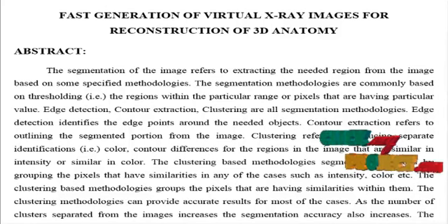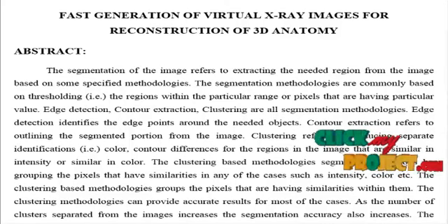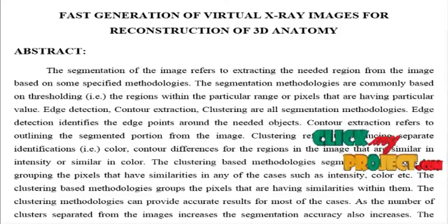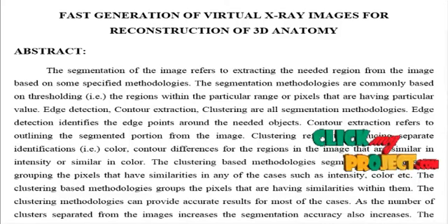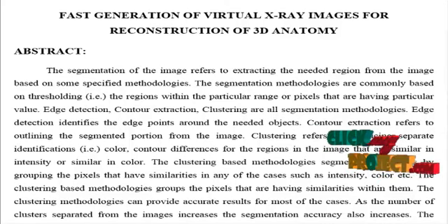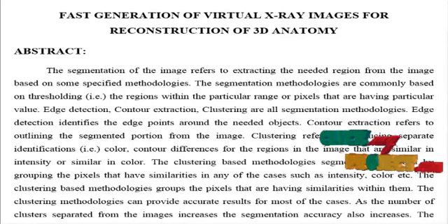The proposed FCM based segmentation method is a clustering based segmentation methodology. The number of clusters is determined automatically. The images are initially pre-processed using median filter and adaptive histogram equalization. The median filter replaces the identified noisy pixels in the image by calculating the median of the neighboring pixels. The pre-processing step is the basis of all image processing. This process makes the images have the same range of intensities in the whole image.